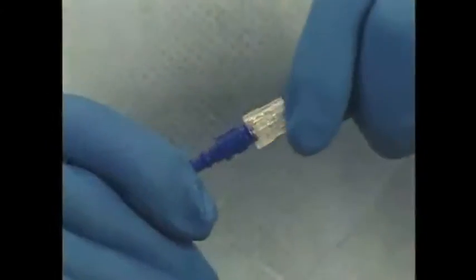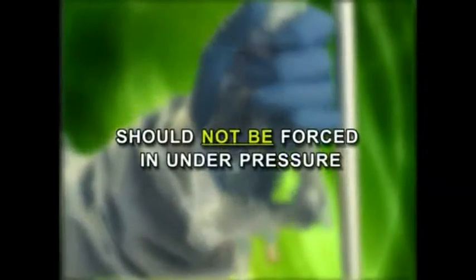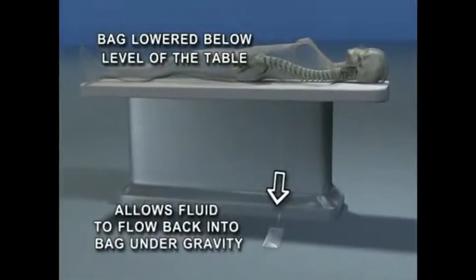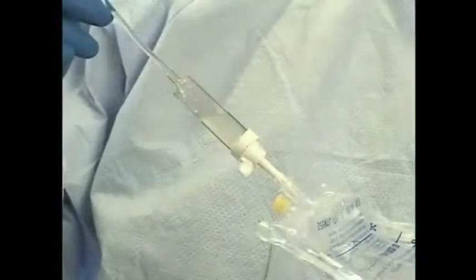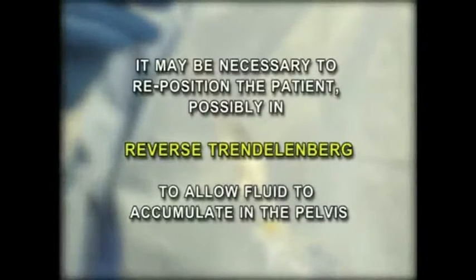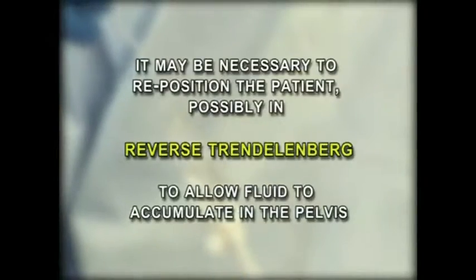A liter of normal saline is then allowed to flow into the abdomen under gravity. It should not be forced in under pressure. The entire bag is not allowed to empty, but a very small amount is left in the bag, and the bag is lowered below the level of the table to allow the fluid to flow back into the bag under gravity. As much fluid as possible is allowed to drain out under gravity, and it may be necessary to reposition the patient, possibly in reverse Trendelenburg, to allow fluid to accumulate in the pelvis.